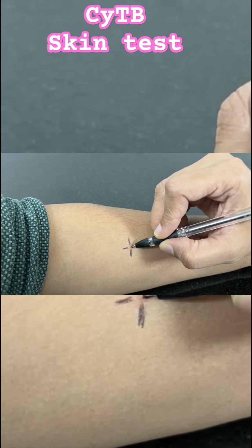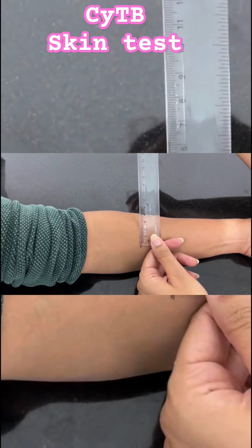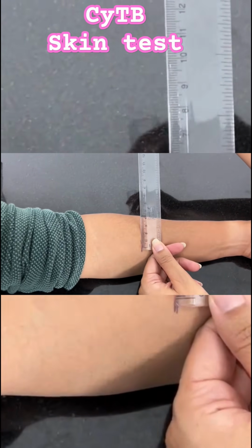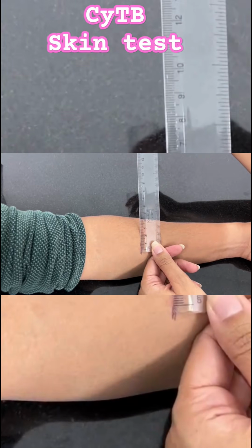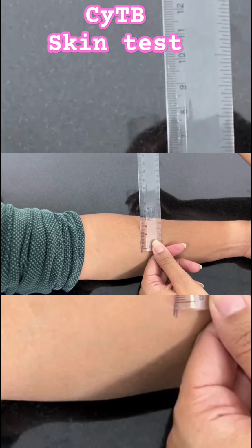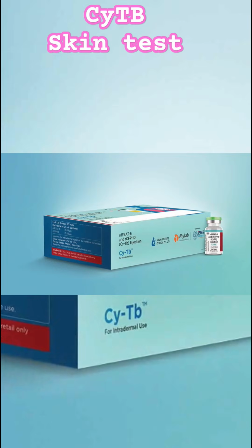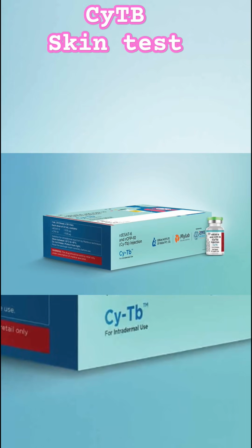Induration can also be measured by a ballpoint method. Record results in mm of induration with size greater than or equal to 5 mm considered as positive for TB infection. 5 mm cutoff is universal for CyTB skin test irrespective of age, BCG vaccination and HIV status. Accurate and reliable detection of TB by CyTB is an important tool for disease control and tuberculosis management.